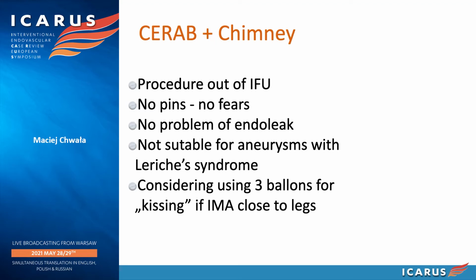And we'd like to remind that it's sometimes wise to consider using 3 balloons for kissing if the IMA is close to the legs in the iliac arteries. We performed so far 3 such procedures with no complications in patients with Leriche syndrome.